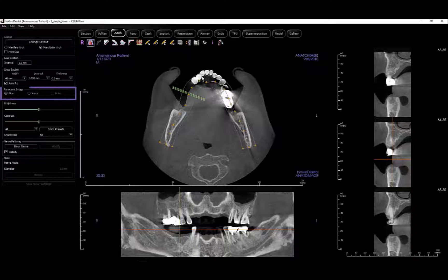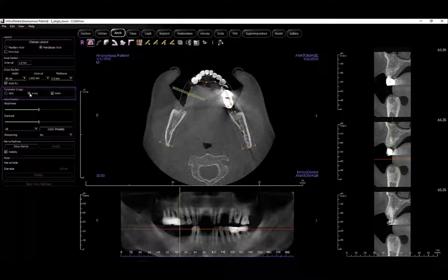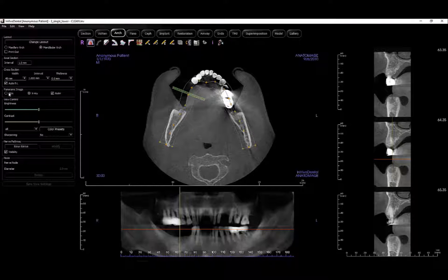This pano is currently in slice mode and may look different than the typical x-ray pano. In order to trace the nerve, the pano will need to be in slice mode to follow the nerve canal in 3D.